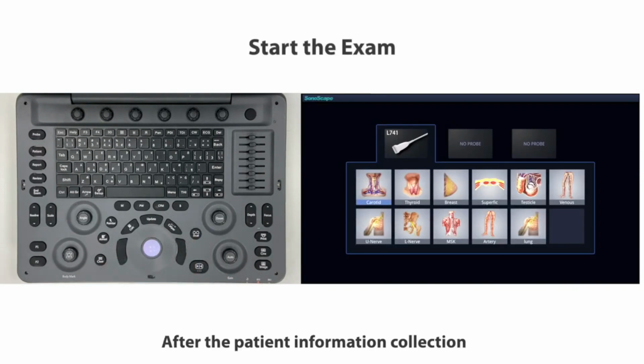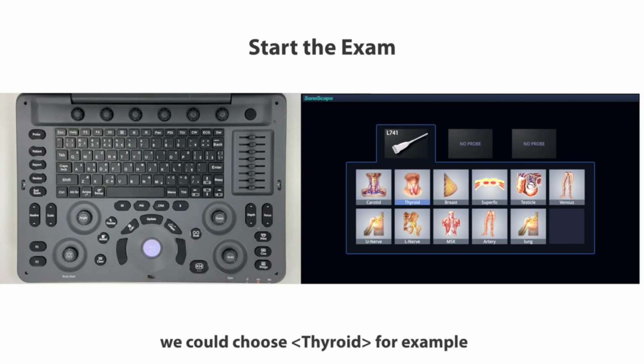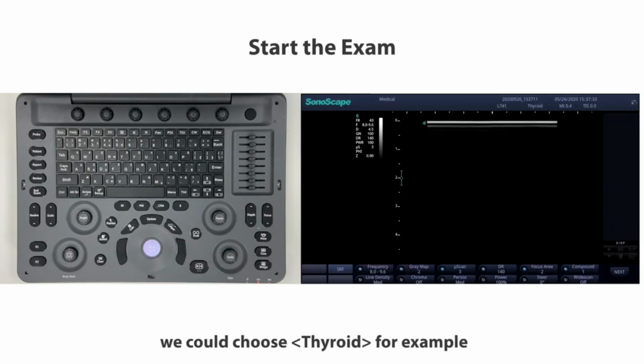After the patient information collection, we could begin the exam by the first step, choosing an exam mode. Here is the exam mode display. We could choose thyroid, for example.